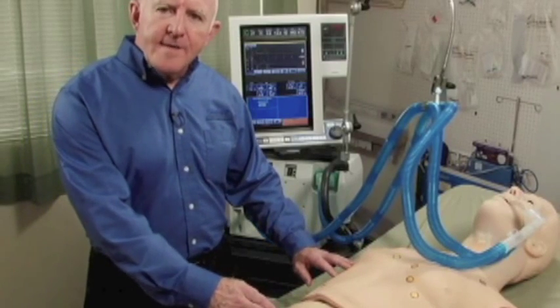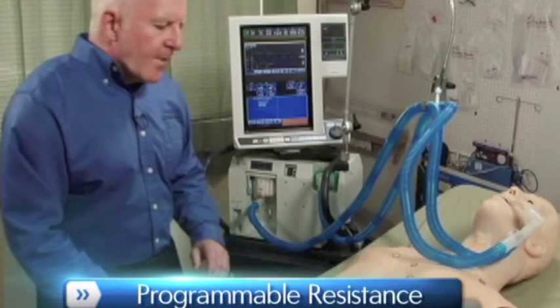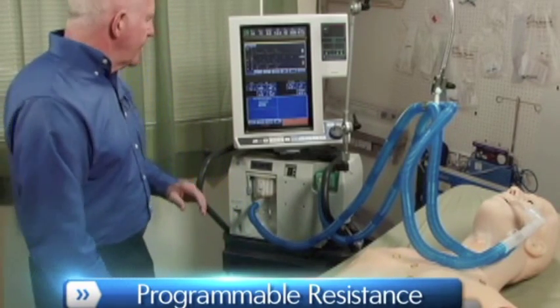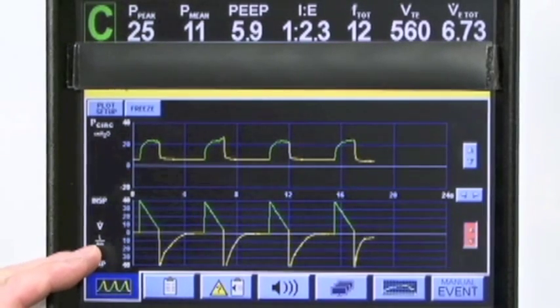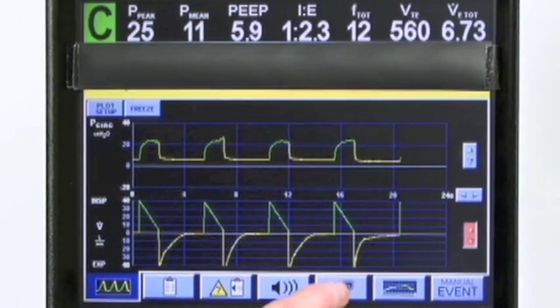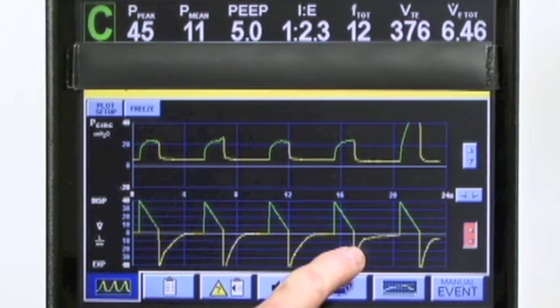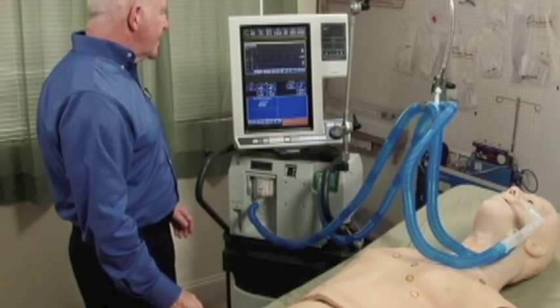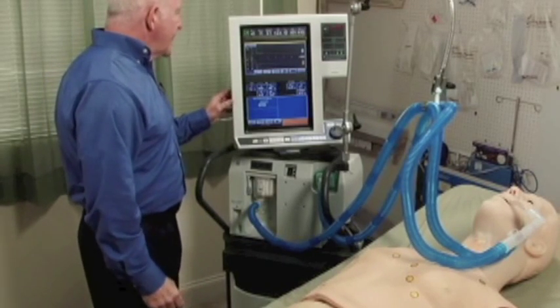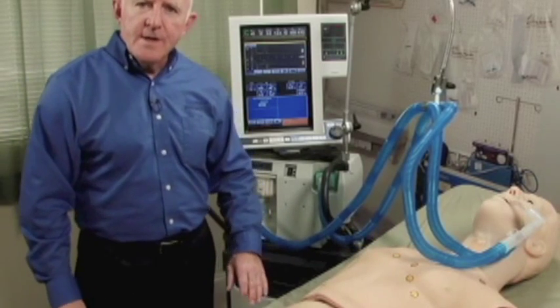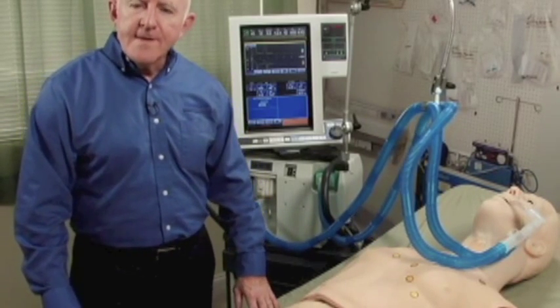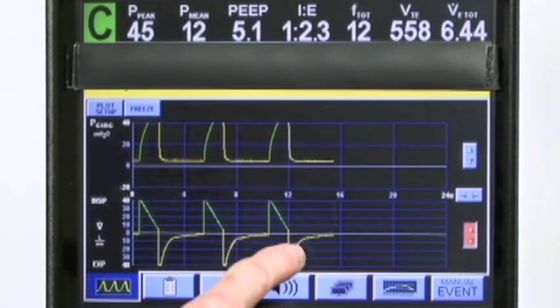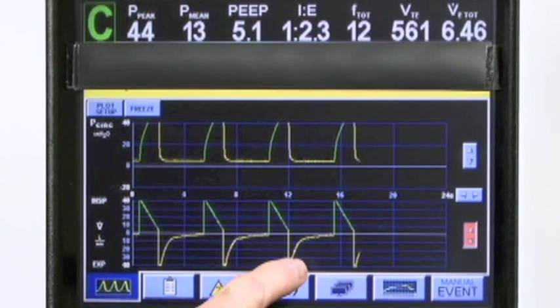HAL has 10 variable resistance settings. Right now we have HAL in a unilateral resistance, and you can notice on the graphics that we have some very mild delay in expiratory flow — exactly what you would expect with that level. Now, if we go to a more extreme situation with moderate resistance on both sides, we'll notice a very realistic delay in expiratory flow rates.